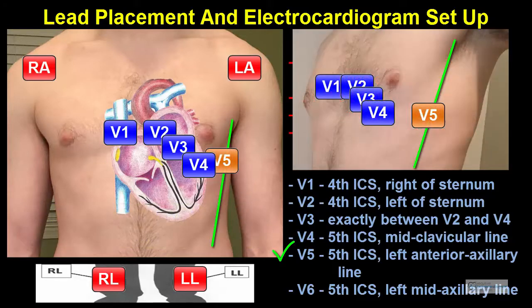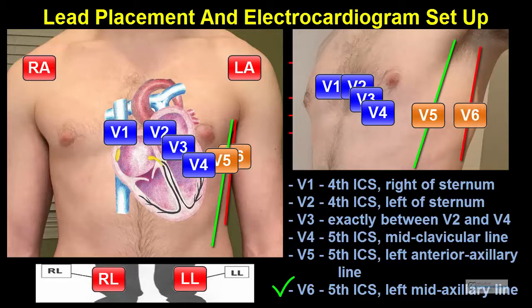V5 is placed in the 5th intercostal space, even with V4 in the left anterior axillary line. Finally, V6 is placed in the 5th intercostal space with V4 and V5 in the mid axillary line.